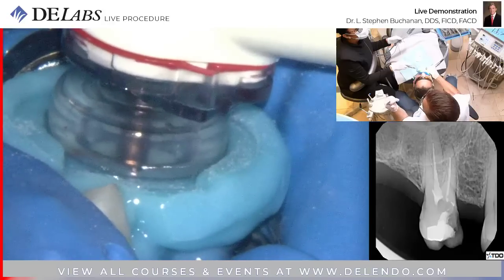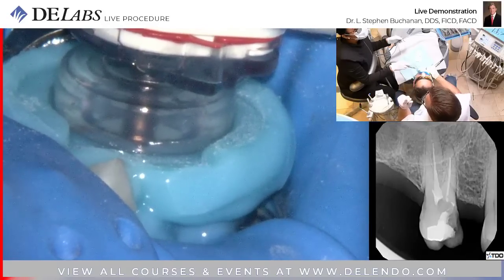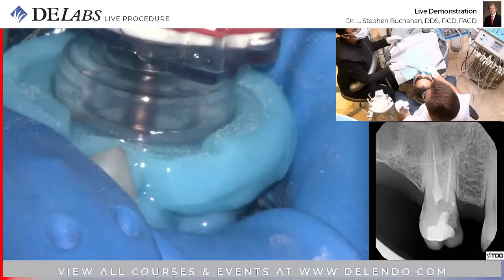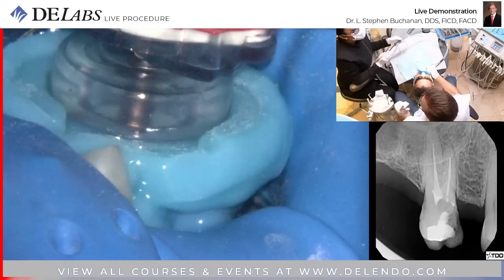So that's what I'm saying, with this one device, they create a negative pressure and they resonate this thing in a way that there's no other energy source, I think, that would have the same effect. We're at 1 minute and 19 seconds. We have no air bubbles. Things are going pretty well.